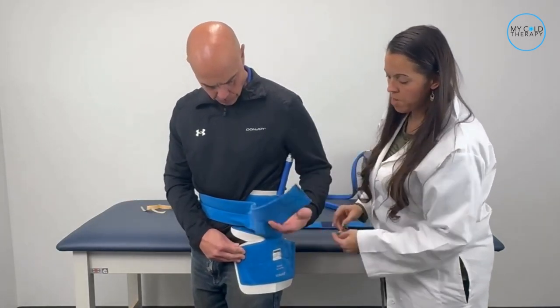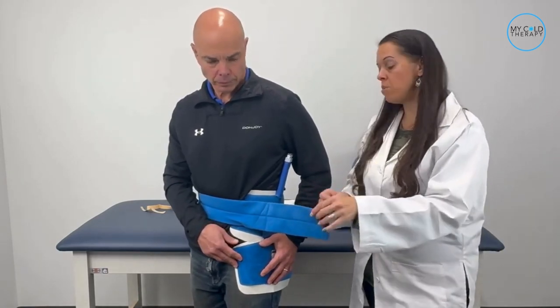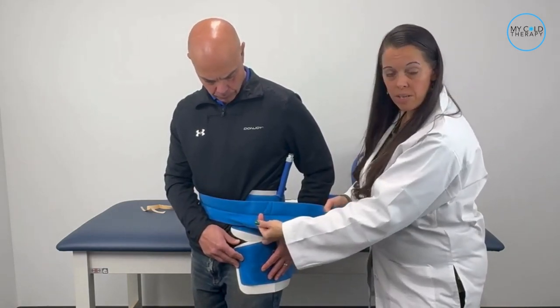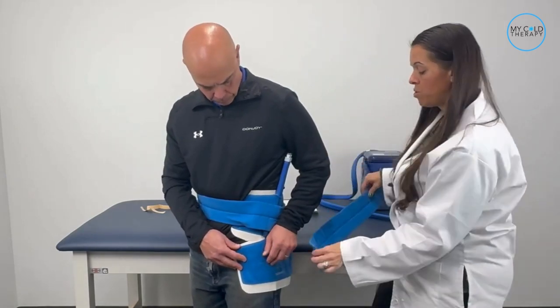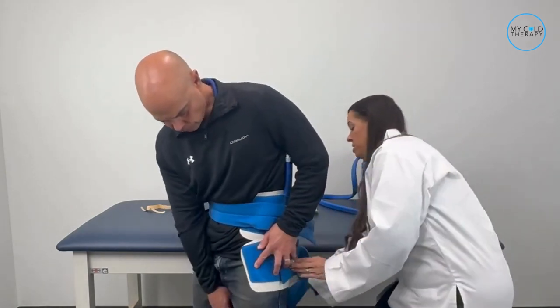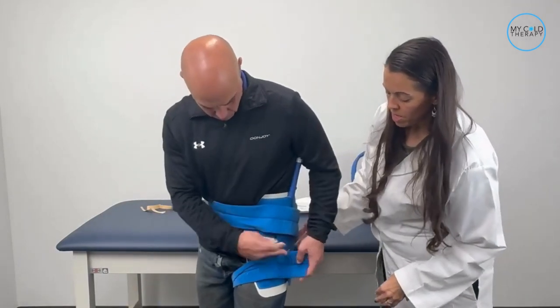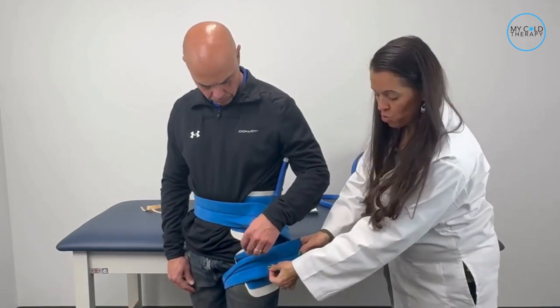The straps are designed for different body types, so whether you're smaller or larger, they're made to go around you. If it's a little bit long, you can feel free to cut it. After applying the waist strap, apply the one that goes around the thigh — bring it around and attach it. The same applies here: if it's a little too long, you can just trim it.